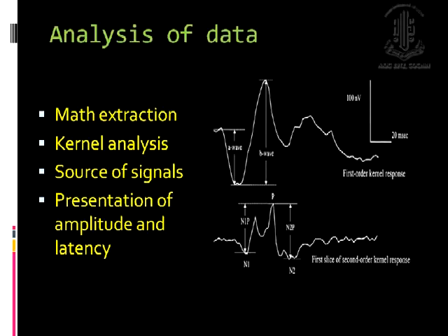And at the end, when you want to analyze the data, you can normalize this amplitude difference, and you can come up with a good idea about how different the center is from the periphery, how different a peripheral spot is from the next spot, how different this peripheral spot superiorly is from the peripheral spot inferiorly. So the topographic presentation is the main objective.